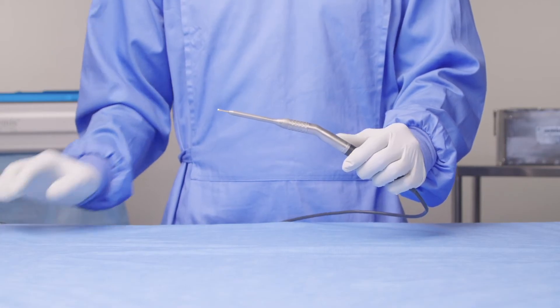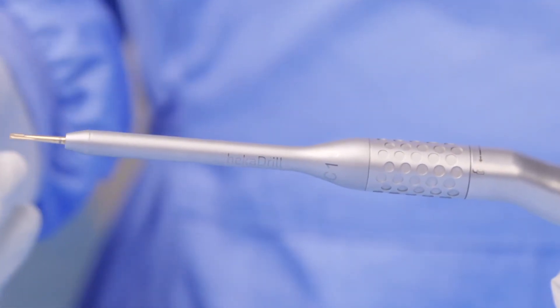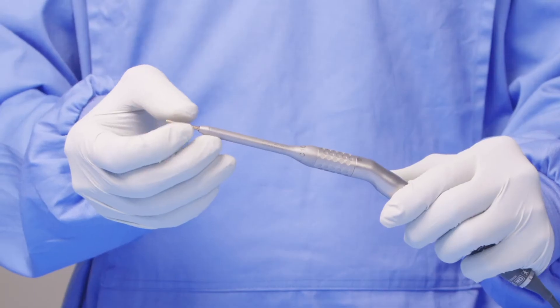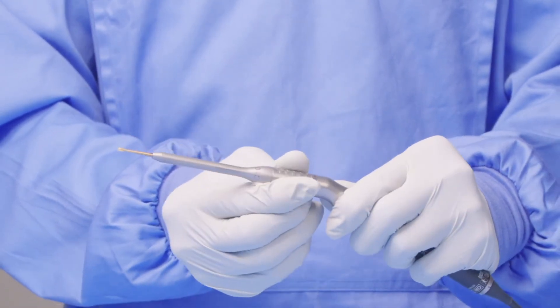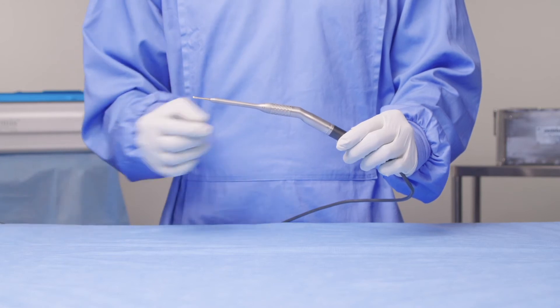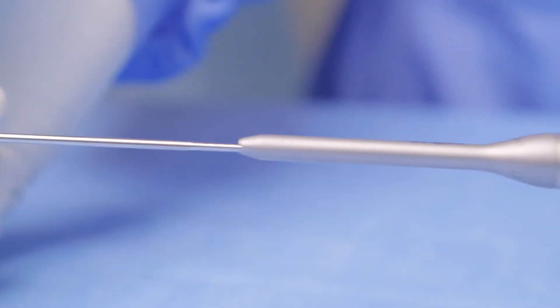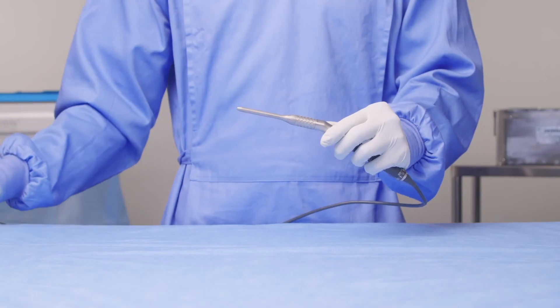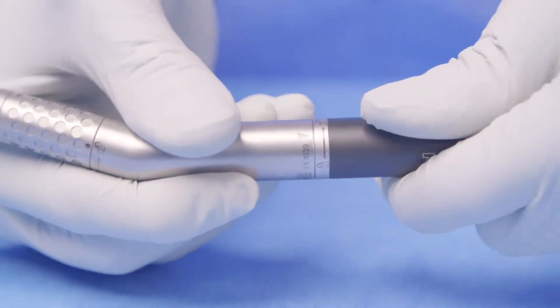Once finished with the burr, you can unlock the system from the lock here. Once you've got it to the appropriate length, you can lock the system again by twisting this locking mechanism. When finished with the burr, you can unlock the system, take the burr out, and then remove the whole attachment by twisting from the locked position to the unlocked position.